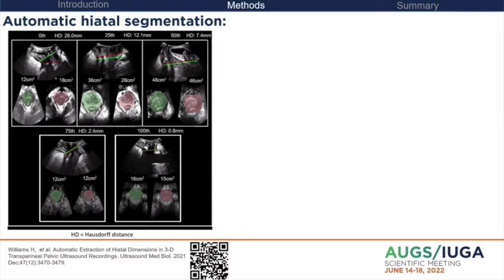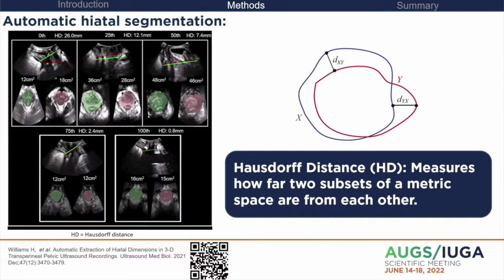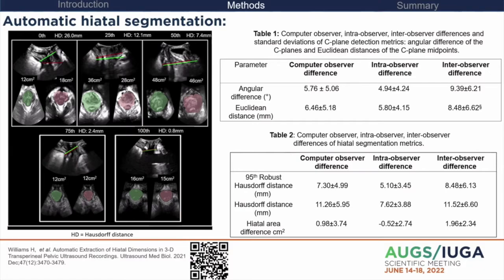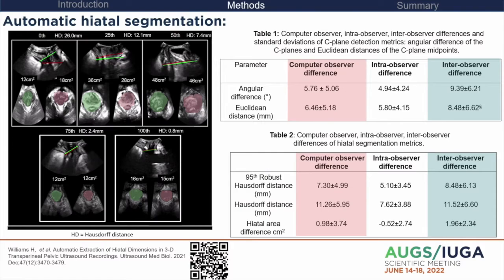I have some visual results to show. The evaluation metric is the Hausdorff distance, shown from the 0th to 100th percentile result. The Hausdorff distance measures between the two closest points of one curve to the other — the bigger the number the worse it is. The green line and green mask are from our expert and the red are from our algorithm. From the 25th percentile result, the position of the plane of minimal dimensions is extremely similar to the expert, and the segmentation and area are comparable. The key finding from the tables is that the computer-observer difference is lower than the inter-observer difference, meaning automating this process has standardized the task and could increase the number of clinicians able to perform it.